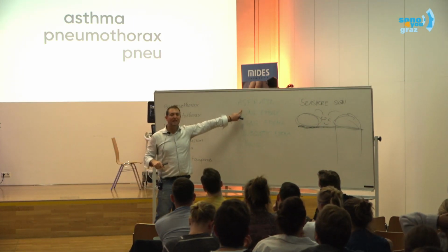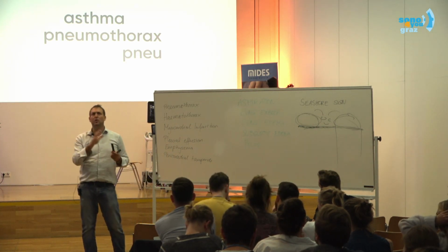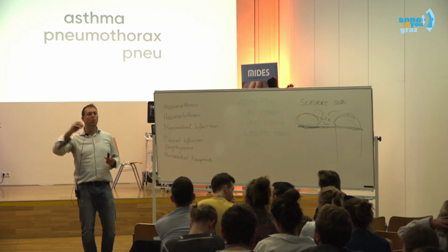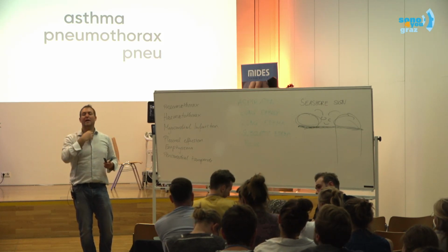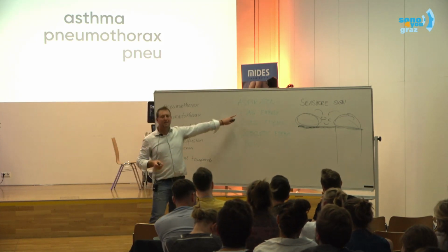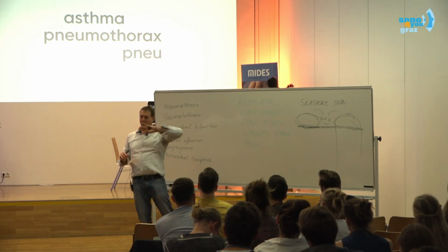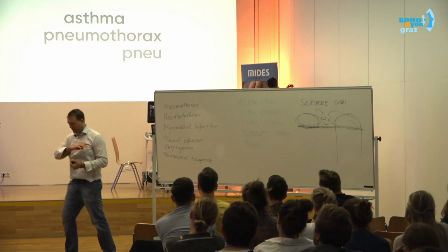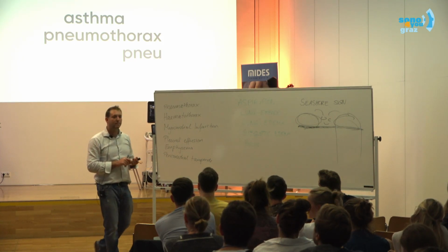Pericardial tamponade, yes, we can see, but that's in the echocardiographic heart, right? Aspiration, can we see that with lung ultrasound? I would say if it produces chemical pneumonitis, then yes. But otherwise, whatever is up in the trachea, you cannot see. Lung emboli or pulmonary embolism. This is the only case that I wanted to show you, but we will discuss it here. Can you see that on lung ultrasound?